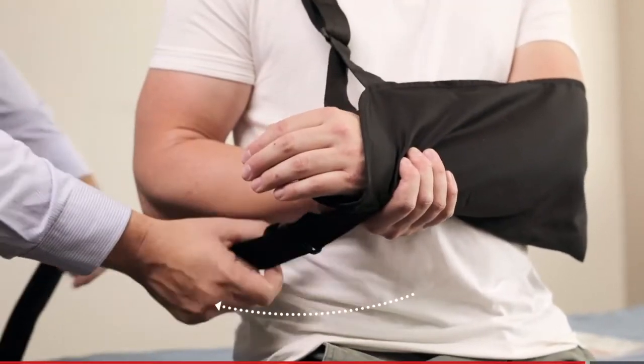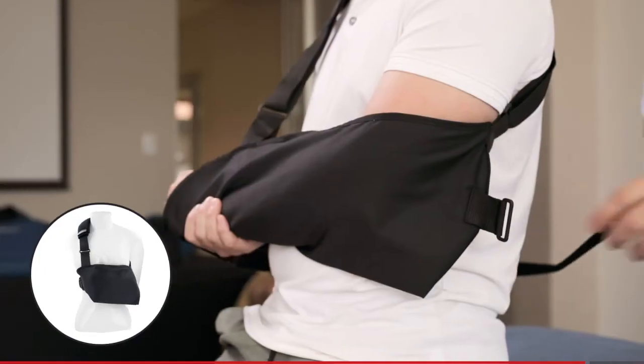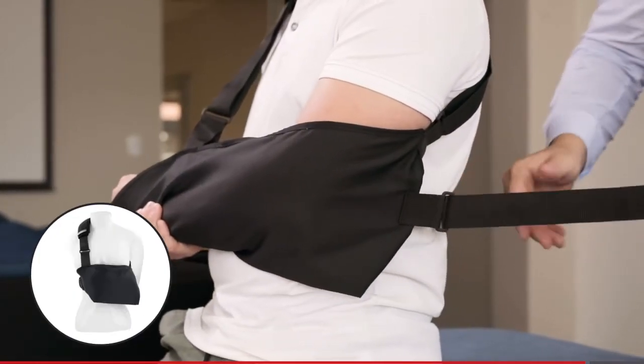Then pass the waistband around their back and fix the velcro strap to the sling at the buckle near their hand.